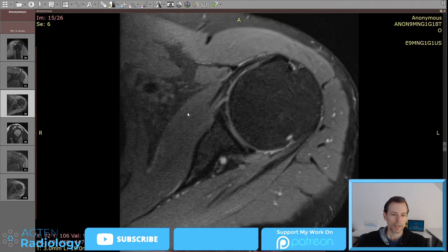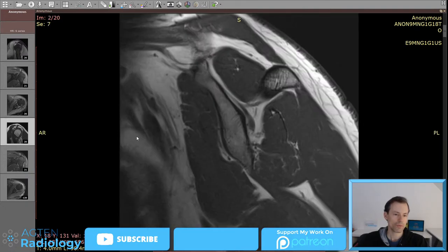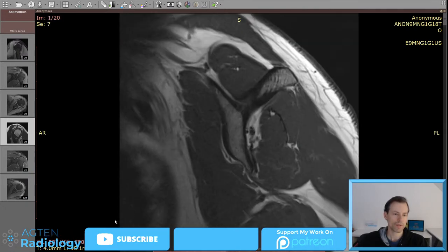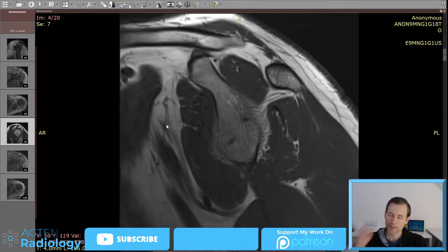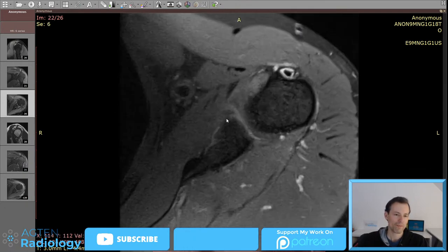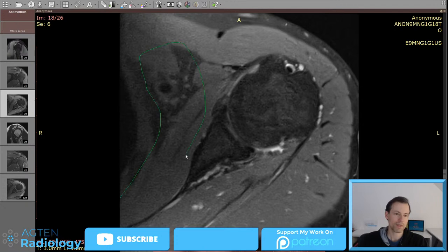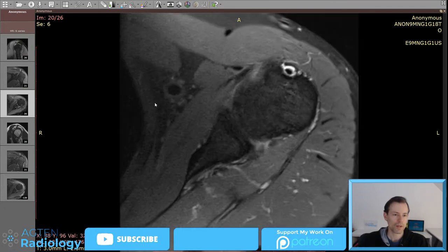So going back to the template, we would now have basically the axilla. Make sure we don't see any kind of cancer in the lung and no lymphadenopathy. You really don't want to miss this. Just recently I saw a case where there was a desmoid tumor, like, I'm not kidding, this big, and it was not described 2 years ago. Luckily for the patient, it was still the same size.